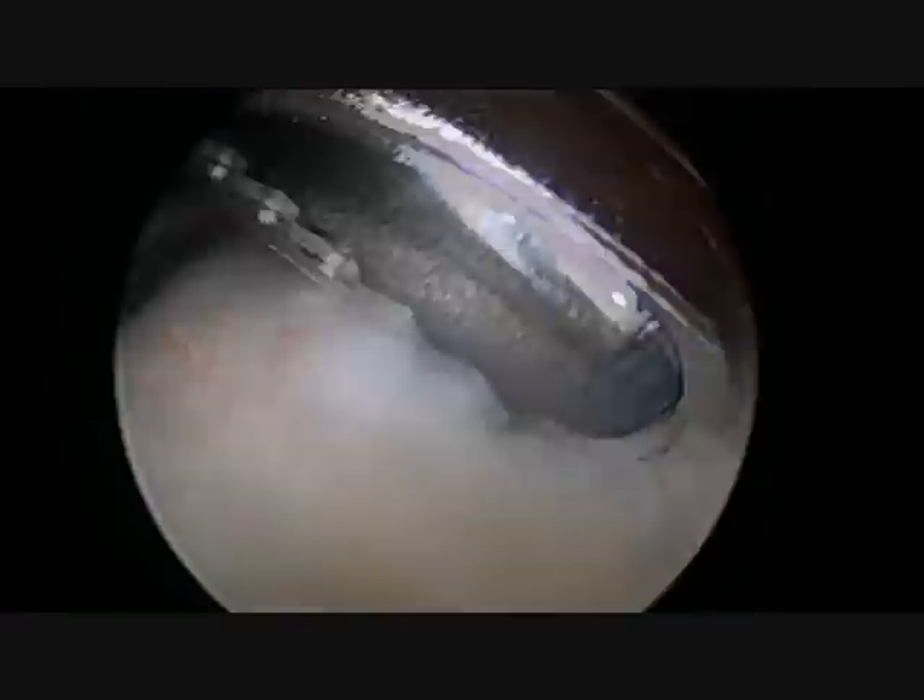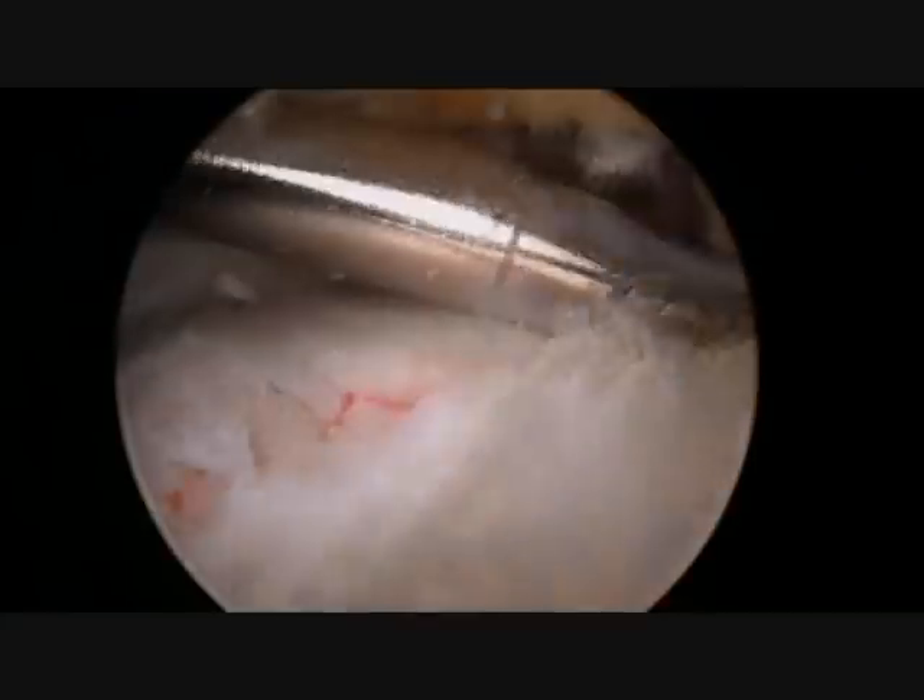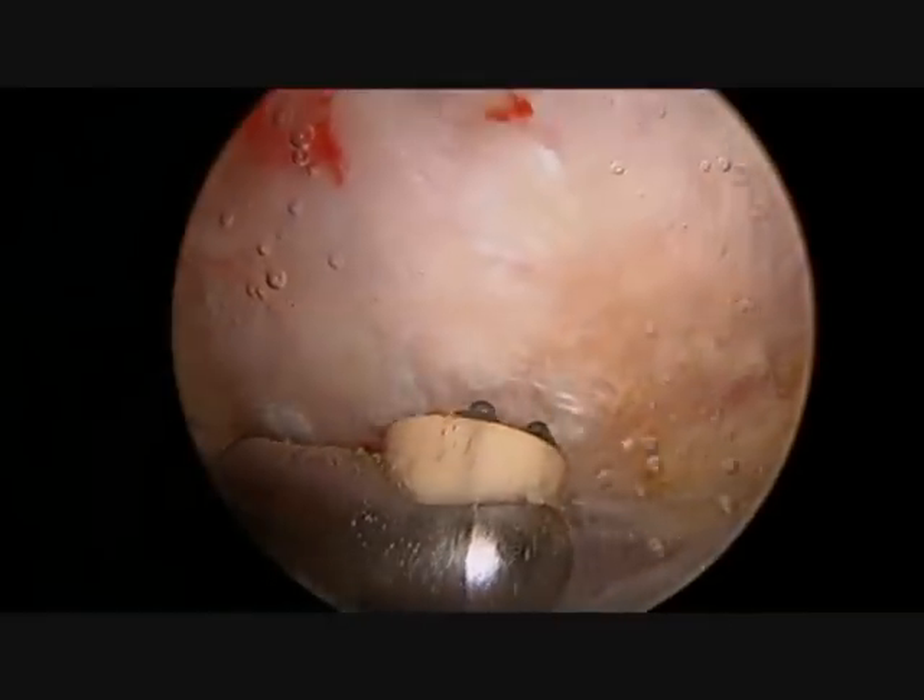Here we can clearly see a large amount of bursal tissue that is present and is on top of the rotator cuff, which is the large white fibrous tissue on the lower half of the screen.